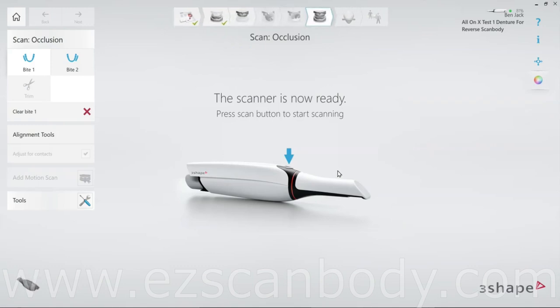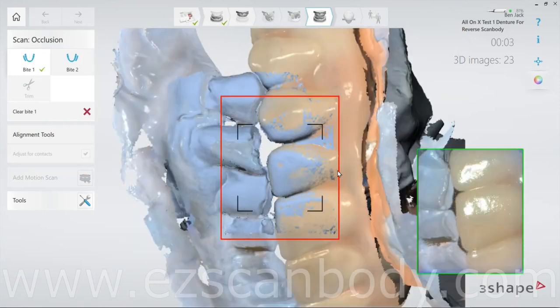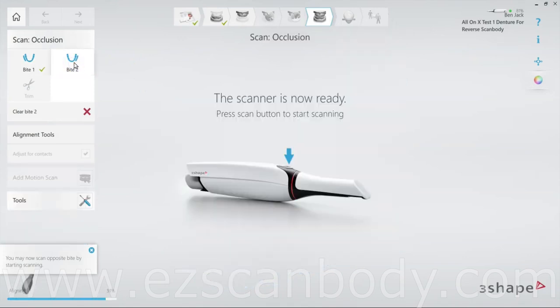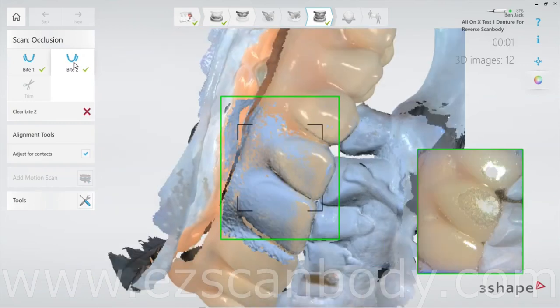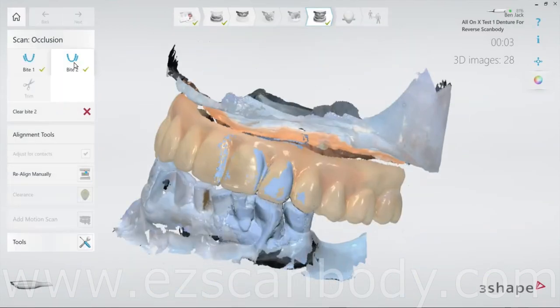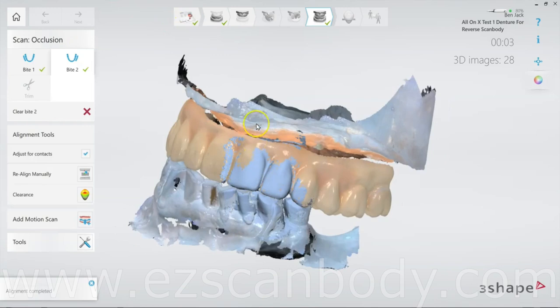When marking the tooth, make sure to click Later to keep all the scans intact and avoid losing any data. To accurately scan the bite, have the patient bite firmly in centric relation. Ensure you scan the buccal surfaces of both the upper and lower teeth, covering at least 3 to 4 teeth on each side. This approach enhances bite alignment and ensures precise occlusion records.